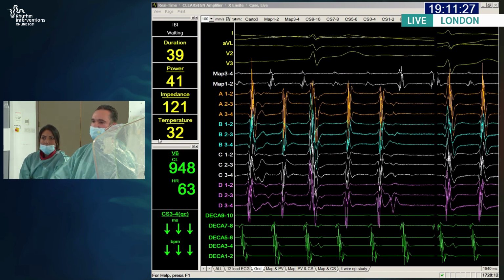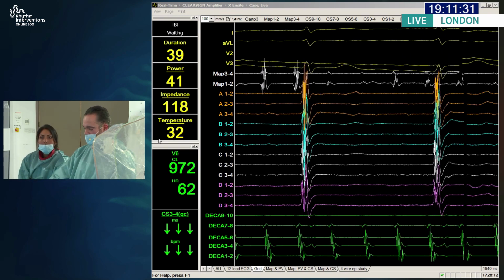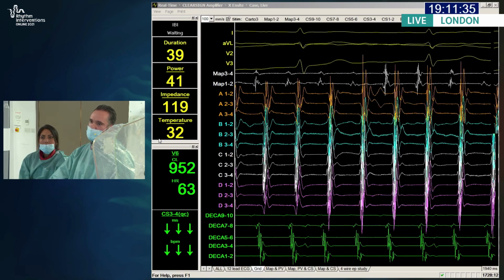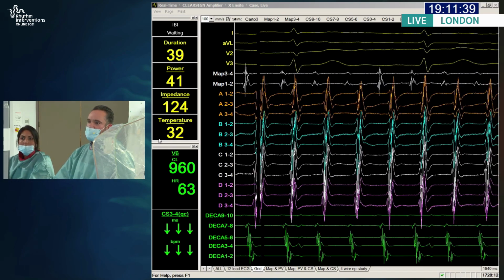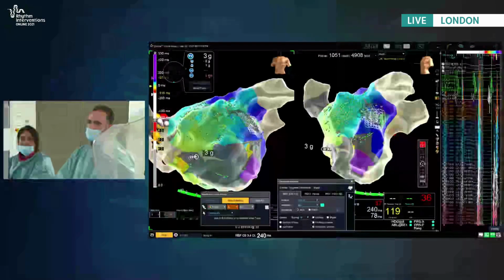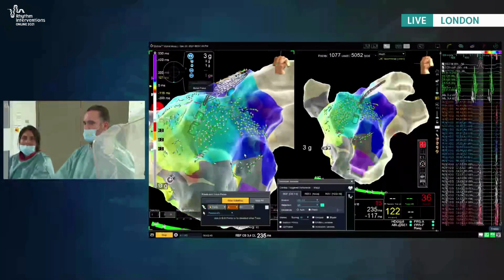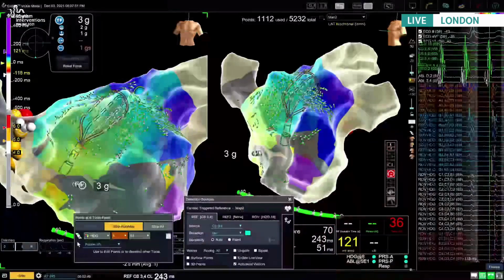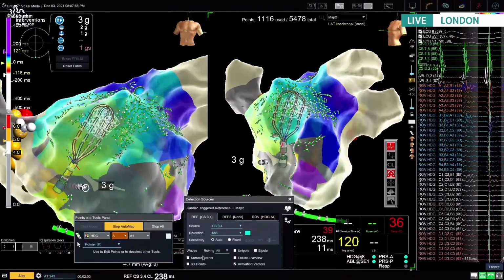or coming from the right atrium. So I suppose it's also one of the omnipolar maps that has a second sort of sense check on it. So you can see the little arrows running everywhere. So on each beat, it'll give you its own appraisal of the directionality of flow. So it uses a combination of unipolar electrograms and bipolar electrograms.